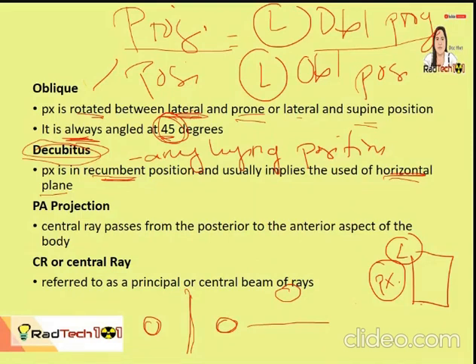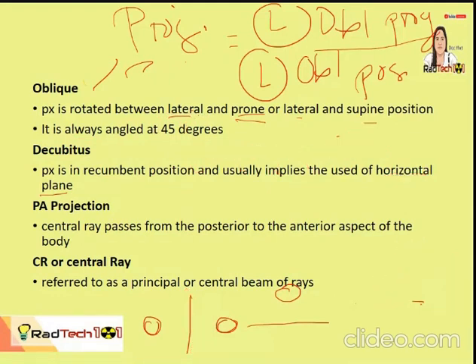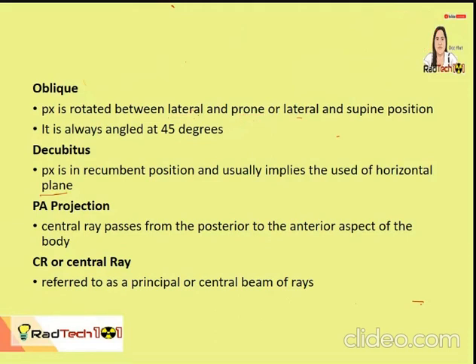So another term is, let me erase this one. Another term is PA projection, which I discussed earlier.